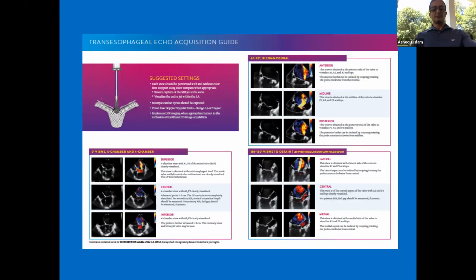I don't know if some of you are involved in structural heart TEE. In the US, this is a very rapidly evolving field. We expect structural heart is going to keep growing. In fact, depending on who you believe, over the next 5 or 10 years the growth could be anywhere between 50% and even 99%.